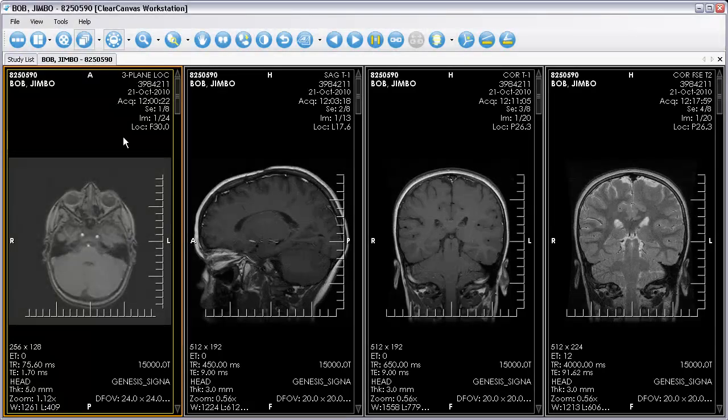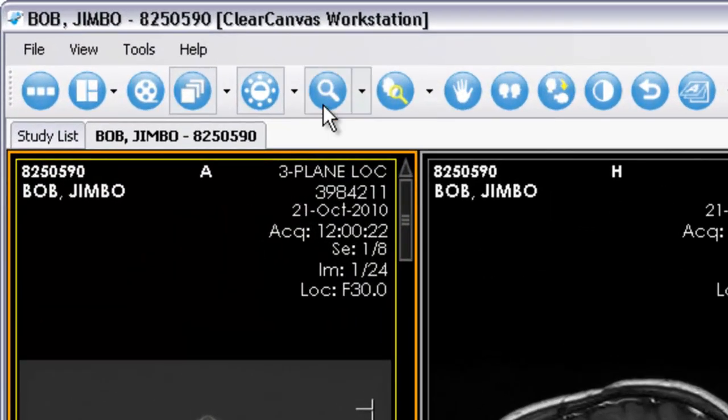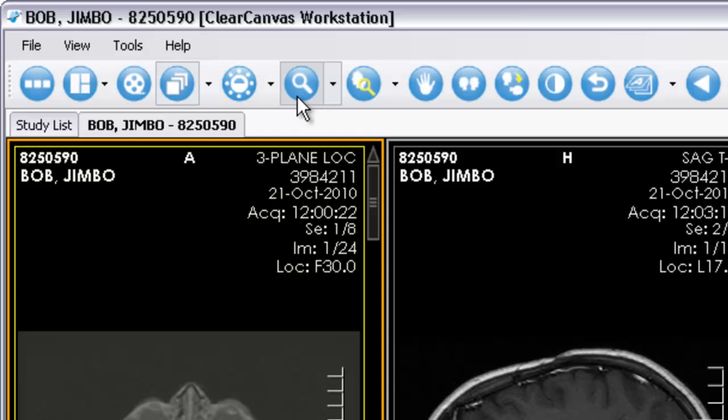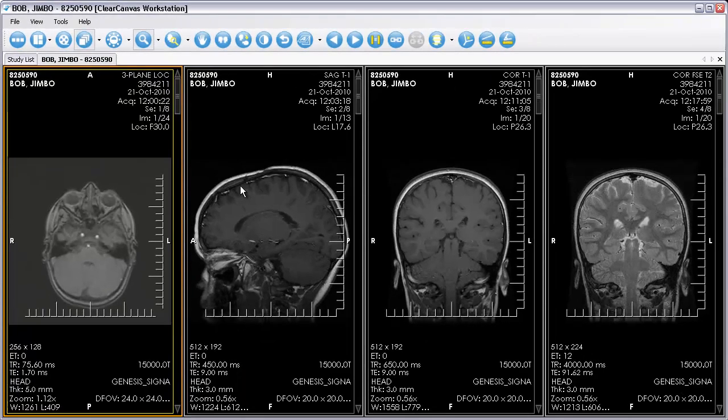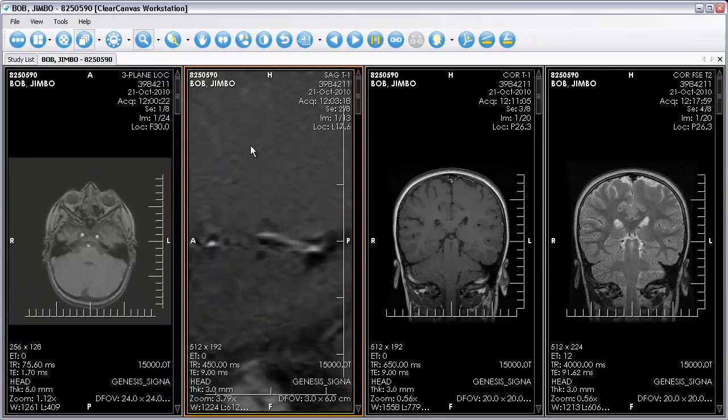You can zoom in and out of images by selecting the zoom tool on the toolbar. Hold down the right mouse button and drag the mouse up or down to increase or decrease the zoom.